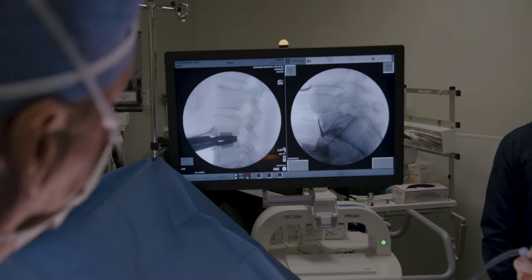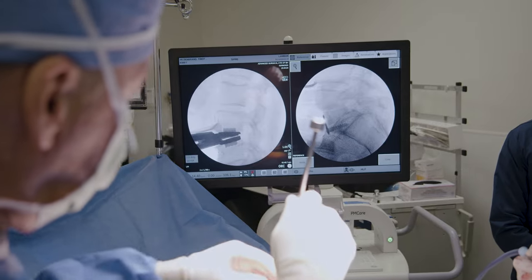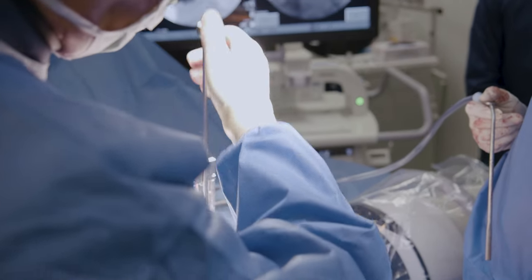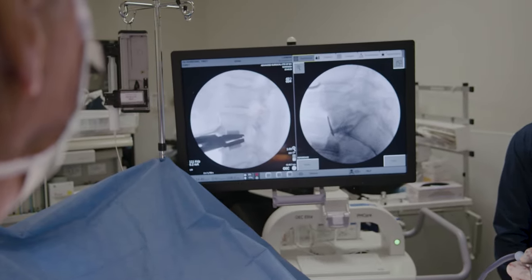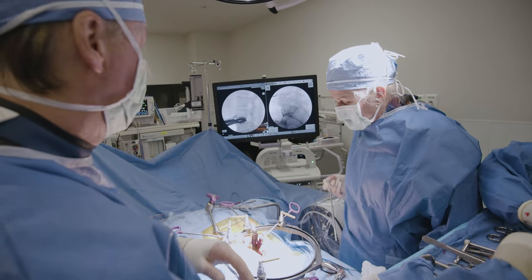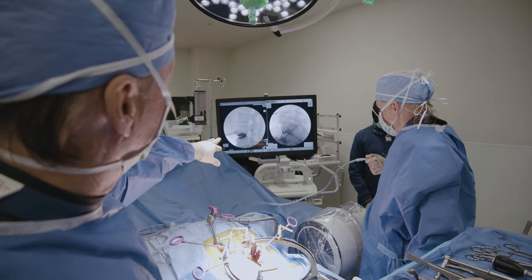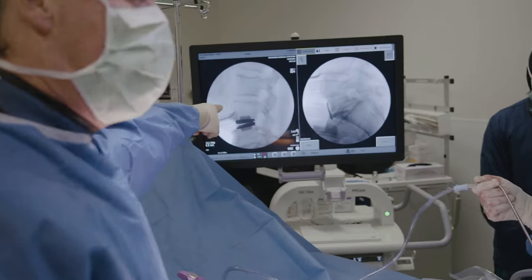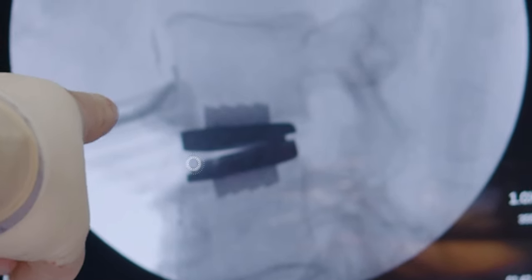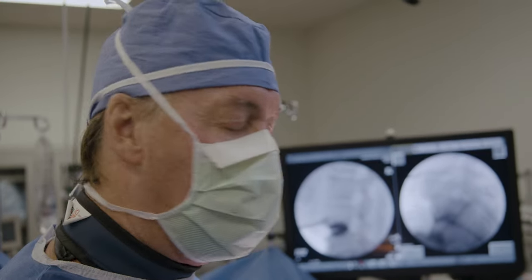You'll see it opening up — there we are. You'll notice the little bead on the front — that's exactly where it should be. The little round bead on the lower piece of the black moving metal on the front edge indicates that the core is snapped into place and in the correct location.